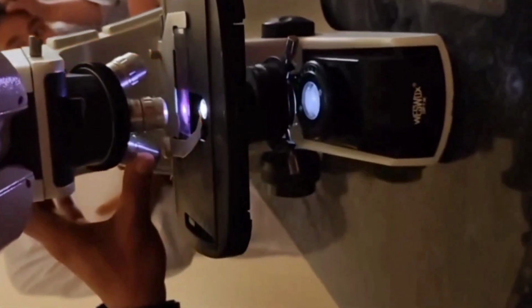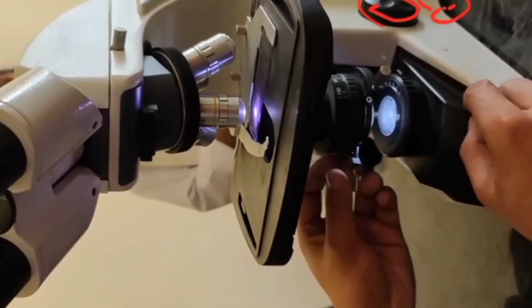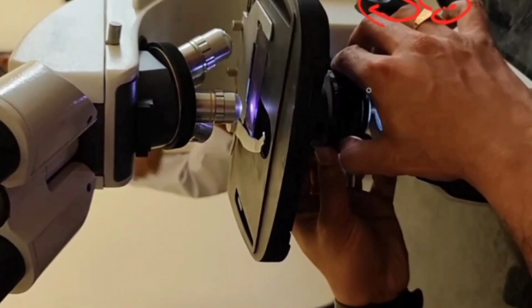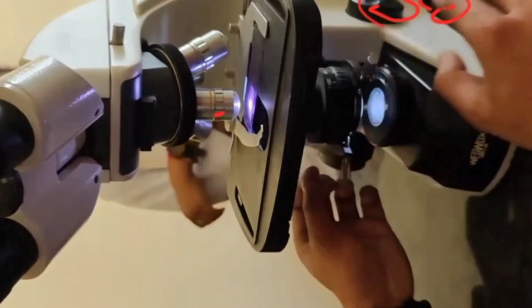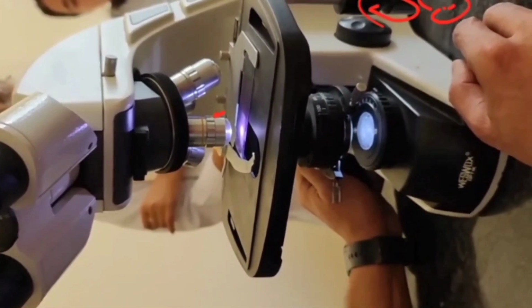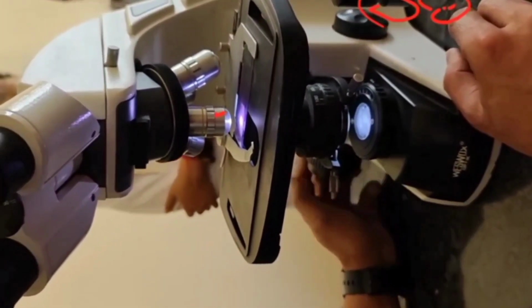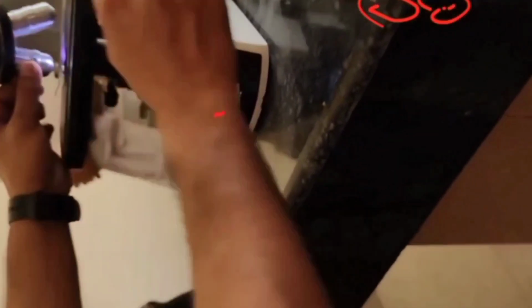I am going to change the magnification power now. It's around 40x high power. I am adjusting the light with the condenser and diaphragm. Because we are using the 40x objective lens, the diaphragm should be mid open usually, and the condenser should always be in the mid position, not so high or not so low. So see under the 40x. Yeah, cells are visible, but it may not be that clear.